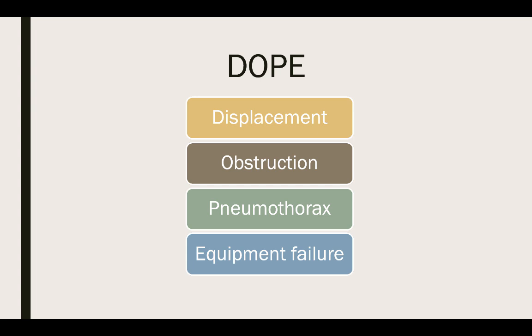And then our last one, these kind of go in order of significance and severity. The last one is just equipment failure, right? So something's gone wrong. We're not ventilating our patient properly. Well, our last check is going to be our equipment check. Is our equipment functioning properly? All right, so we've fixed our alarms and we're taking care of our alarms, but now we've gotten an ABG back that's just kind of weird and odd.